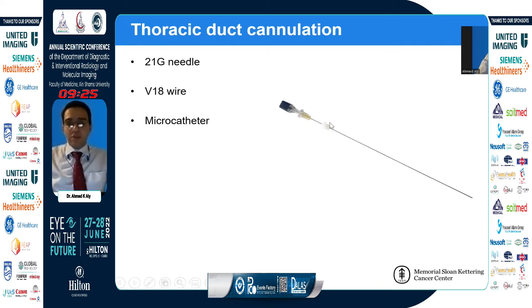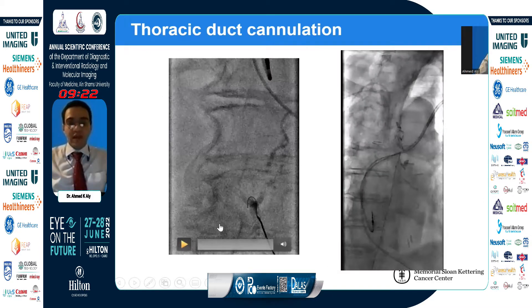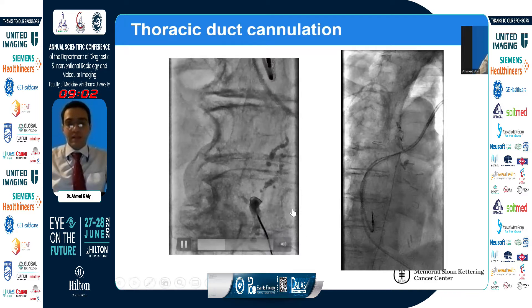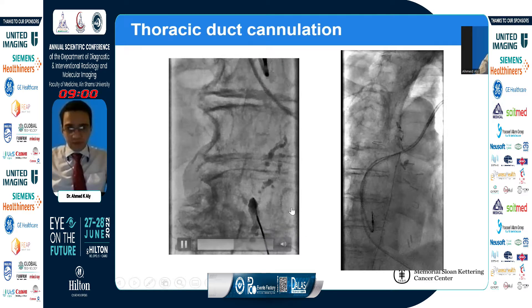We advance this needle under fluoroscopy, directing toward the cisterna chyle in one steady motion until we hit bone. Once we hit the vertebral body, we start pulling our needle back, simultaneously manipulating the wire through the needle until it goes into the thoracic duct. You can see how we try manipulating and finally it finds its way into the thoracic duct going up.